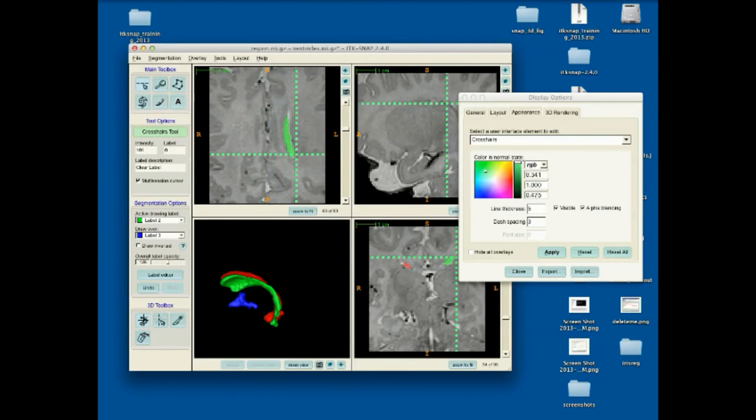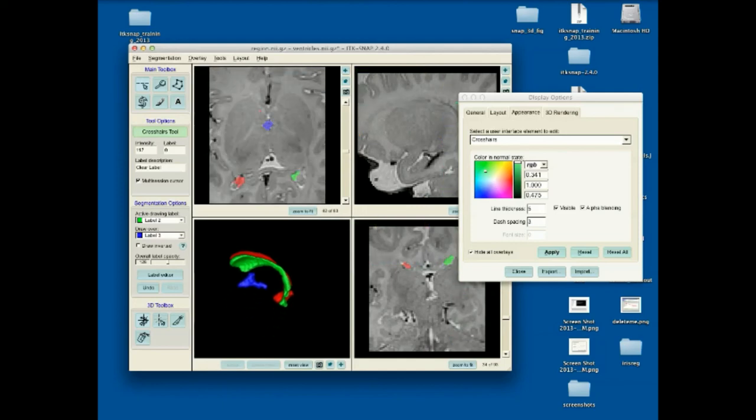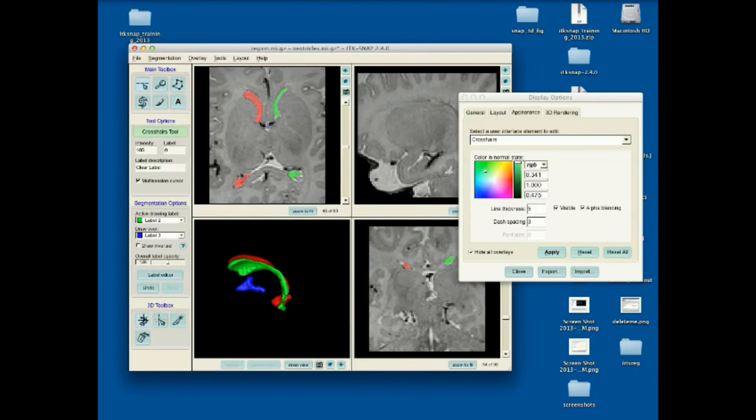There's also the X key, which hides all of the GUI, all of these overlays. So if you need a figure for a paper and you don't want all these letters in the corners, although I like when people leave the letters because then I know they used SNAP to produce their figures. It's kind of fun to see that in papers. But if you don't want that, then you hit the X button and all this stuff disappears. And Shift X just hides the crosshairs.